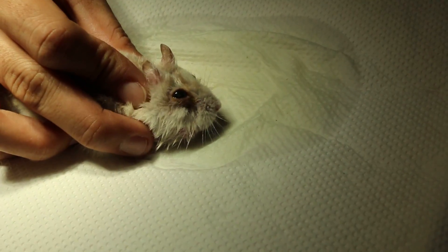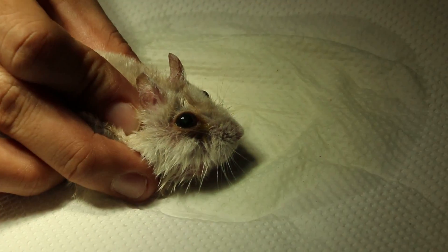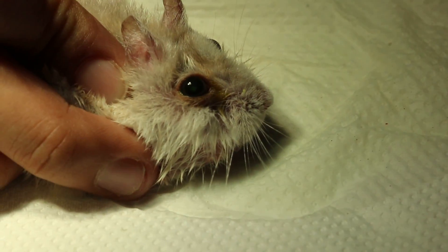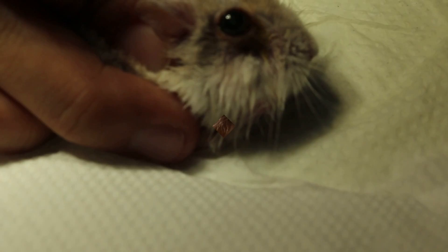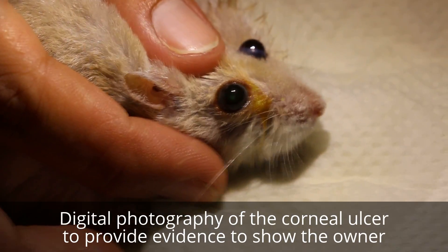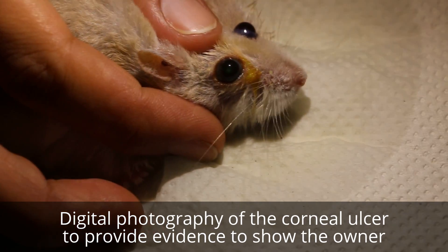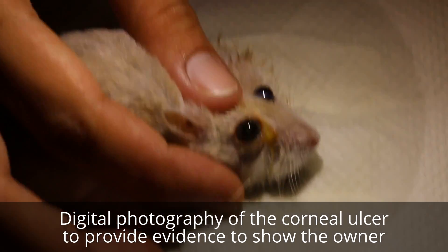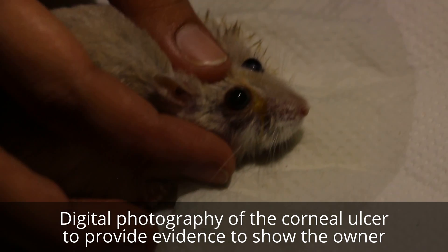This green ulcer is about 2mm. It's not very obvious under the video with the phone camera. There is a central corneal ulcer — the green staining means it is a fresh ulcer. But it's not so obvious from this video due to the lighting.